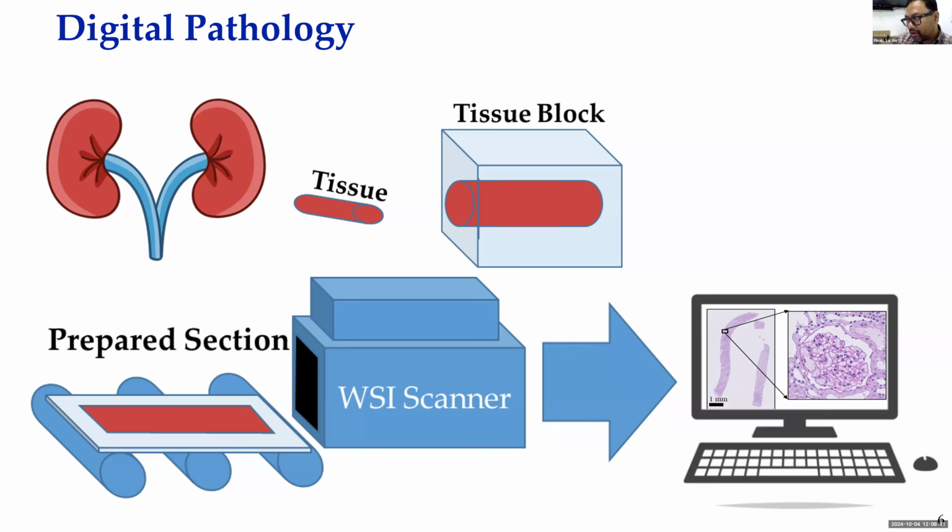Although, in the clinical context, these digital images are still not being used because of regulatory needs that need to be implemented in the clinic.